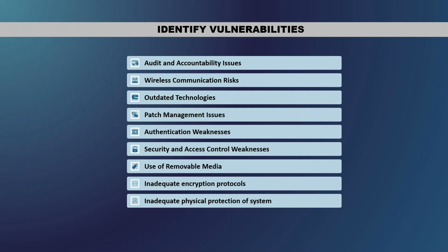And then the use of removable media, that is, if you don't have your hardware ports locked down, anyone that has a USB device can come in and plug it in. Or if a vendor's bringing in security patches or software, they can just plug it in, but they might be using a home USB. With all the different ports available on medical devices now, that's something that needs to be looked at.